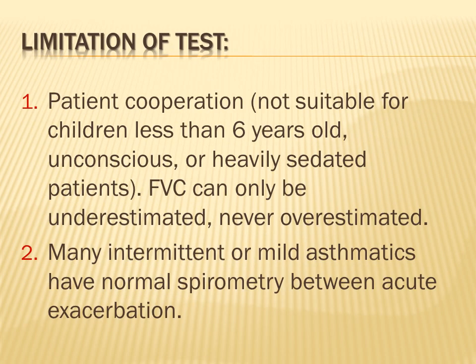Is the pulmonary function test an easy test? The answer is yes and no. It is yes, an easy test if the patient is cooperative, and no if the patient is not cooperative, or if the patient is a young child, and this test is not suitable for children less than 6 years old, and of course it cannot be performed on unconscious or heavily sedated patients.